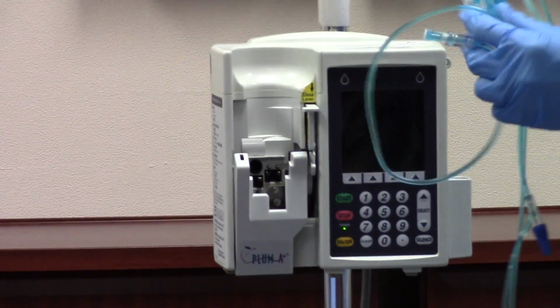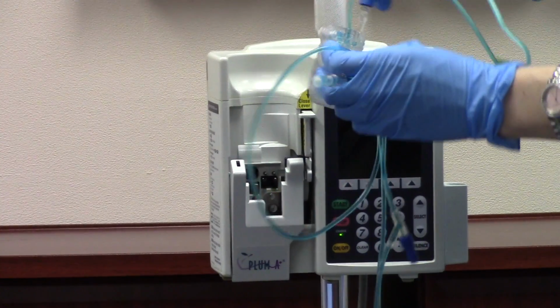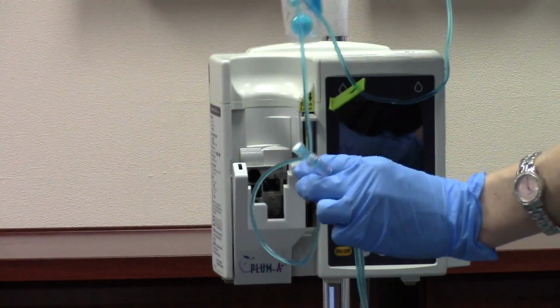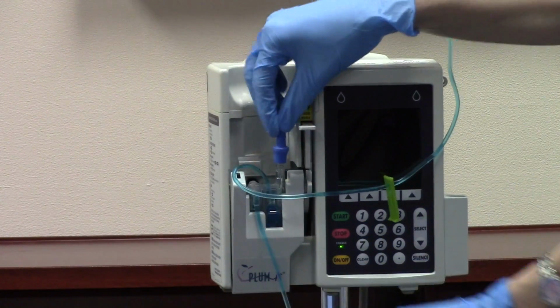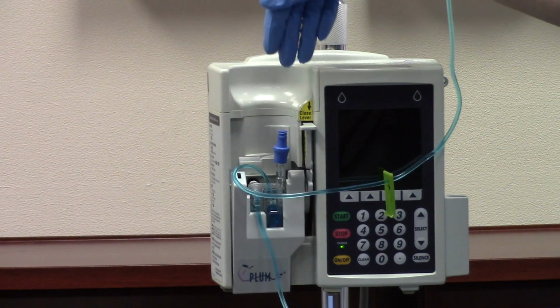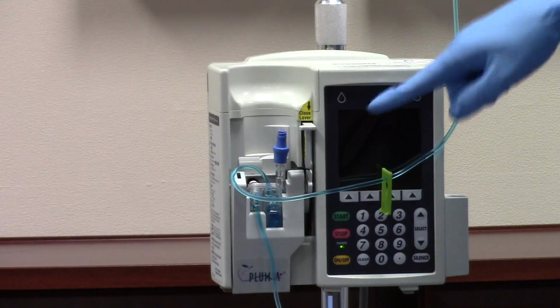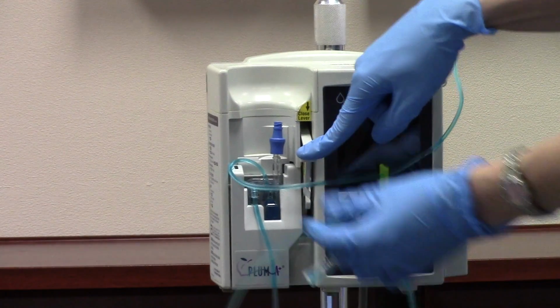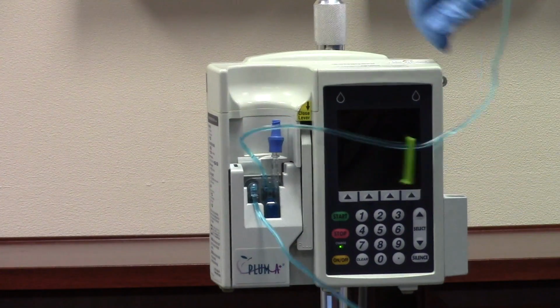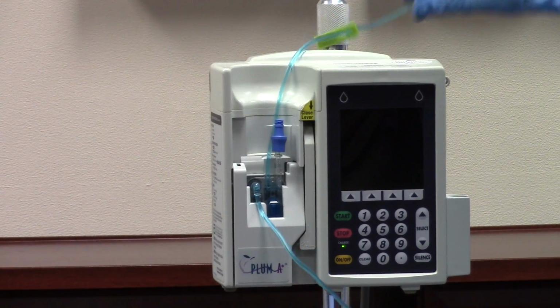The cartridge is to fit in. If you look at the cartridge, it's very natural how it goes in. The tubing should be on the outside where you can see it, and it goes in at a slight angle, so it doesn't go just straight up and down. You're going to miss the cartridge if you try and go straight up and down. Go at a slight angle, and then where we pulled earlier, now you're going to push. And now our cartridge is loaded into the pump. So we're now ready to turn the pump on.